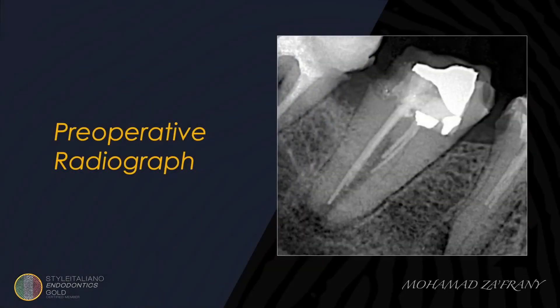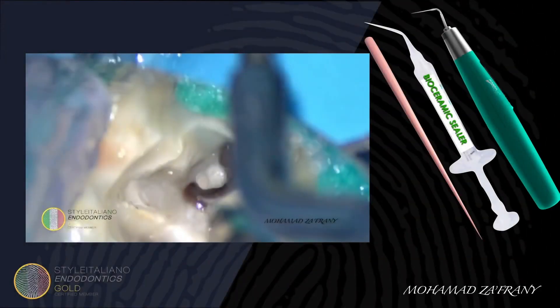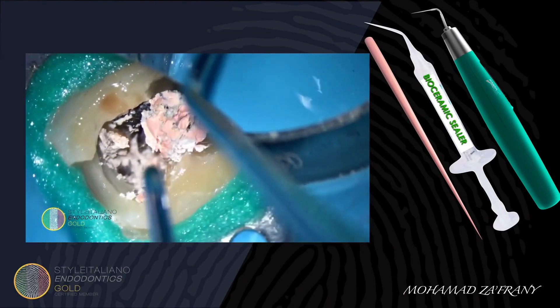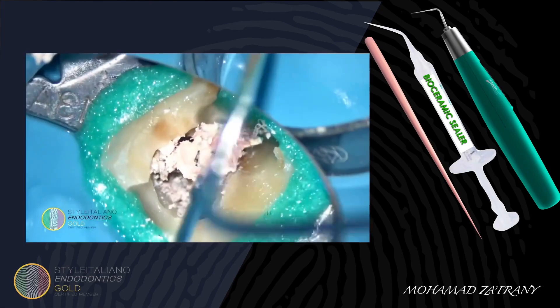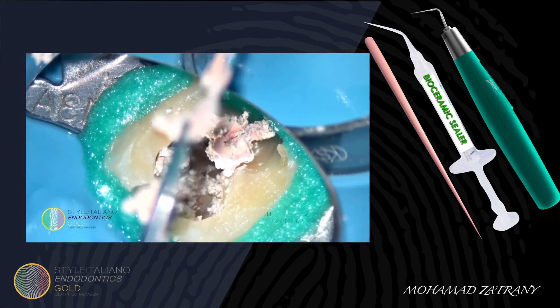This case of retreatment to a mandibular second molar was a C-shaped canal configuration. After removal of the old restoration, we are exploring the old gutta-percha in the pulp chamber. Some gutta-percha were inserted as a single cone, so I'm removing them using a micro tweezer.